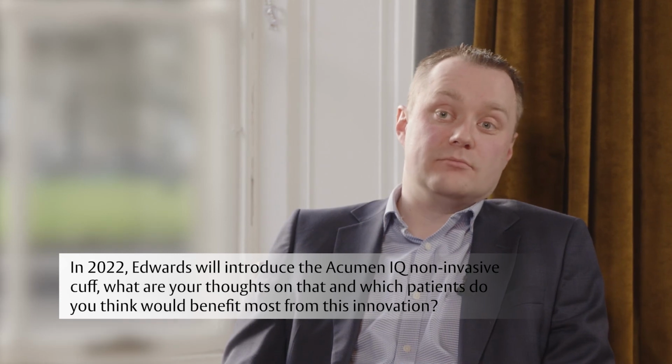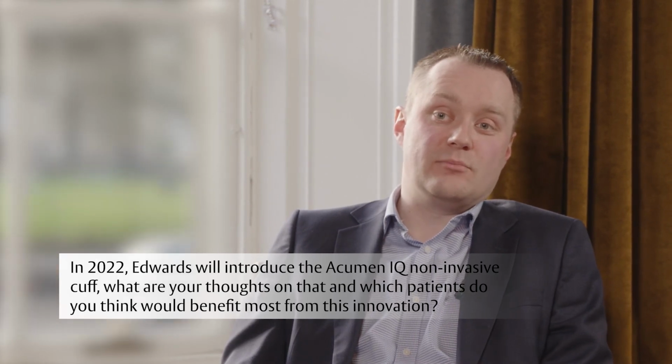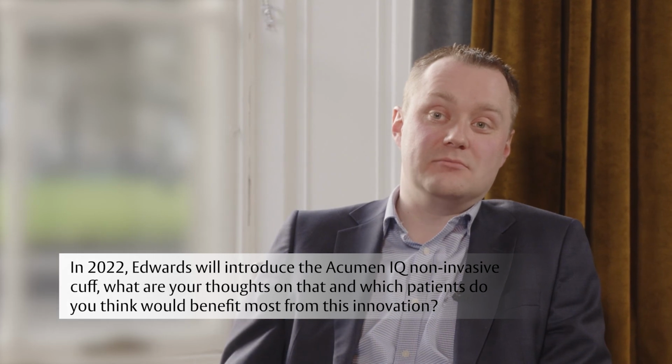I think the secondary parameters are good as well. I think that many of them are directly measured, and so stroke volume variation, dP/dt and Ea dyn, I think these are helpful additions and extra parameters and good information for the clinician to have at hand to then enable them to make decisions which are treatment specific about how to manage the hypotension and how to prevent it as well, hopefully.